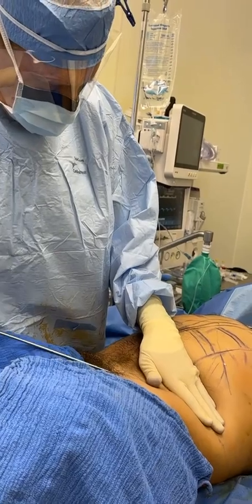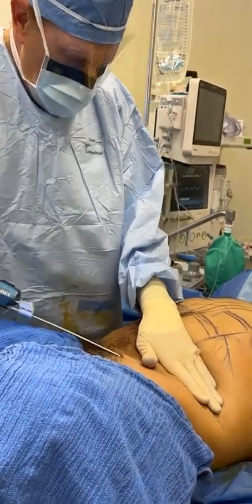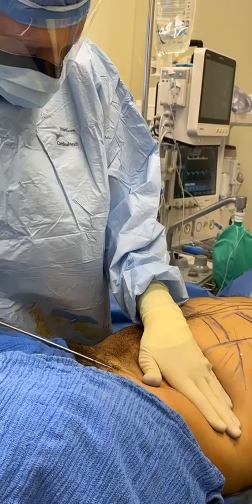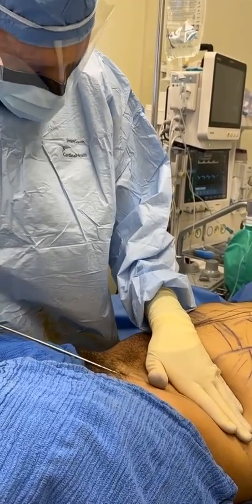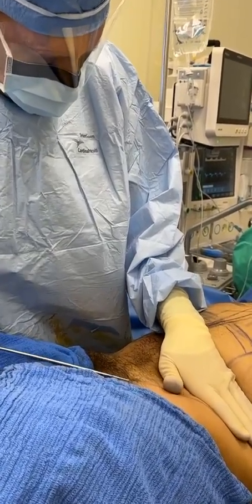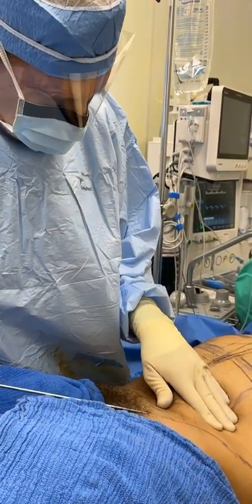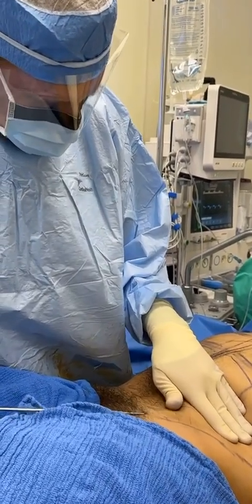I am very, very careful, extremely. I'm exaggerated when it comes to your safety, so that you don't have any issues like that. It's like driving a car. If you go very fast, you may run into trouble. But if you go slow like this, not only is the aspirate bloodless, but you also have less risk.